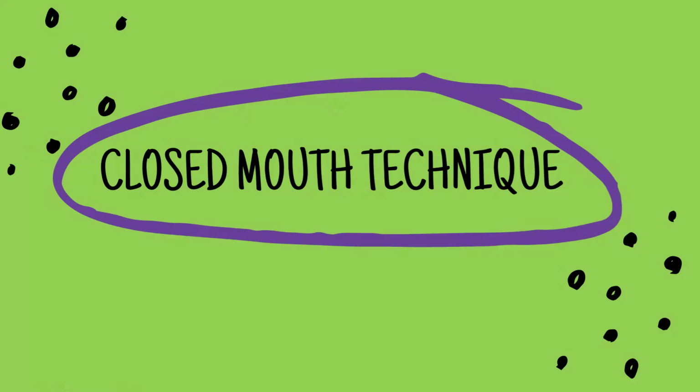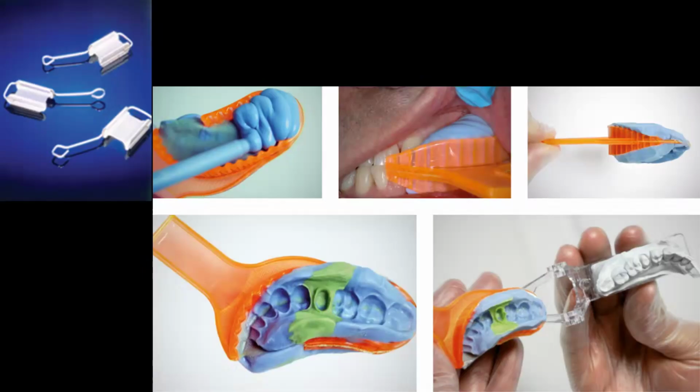Let's also have a look at closed mouth technique. Now, this is performed with the help of triple trays, where you can record the maxillary and the mandibular impressions simultaneously.